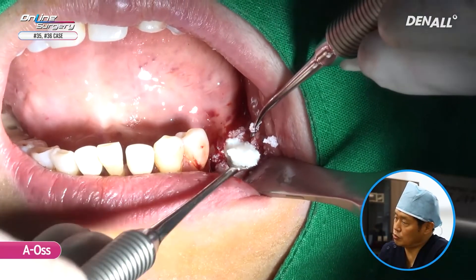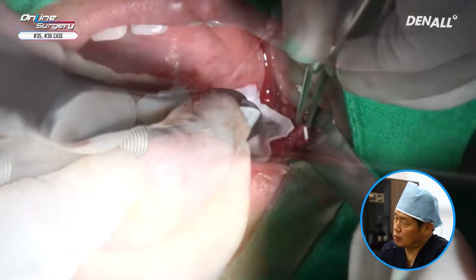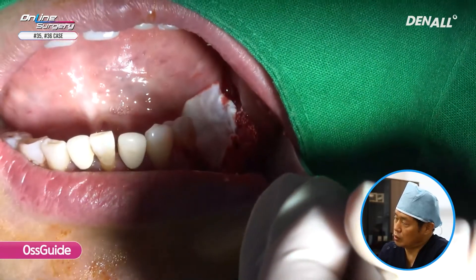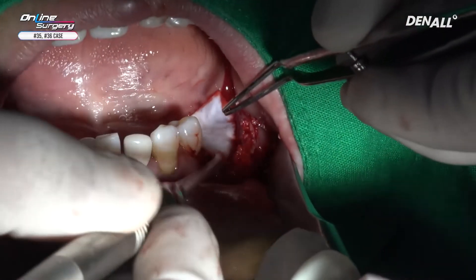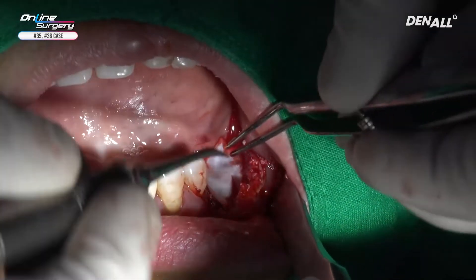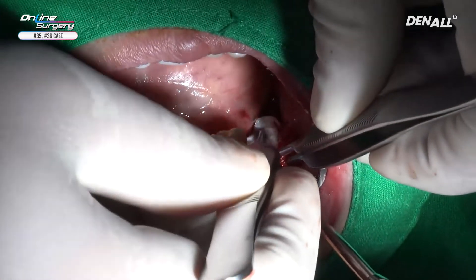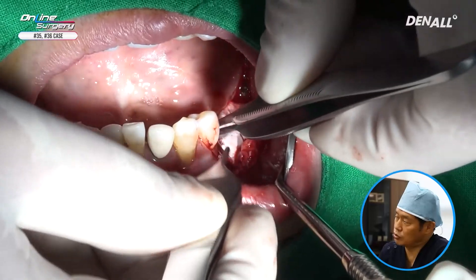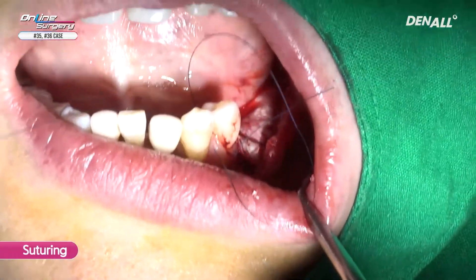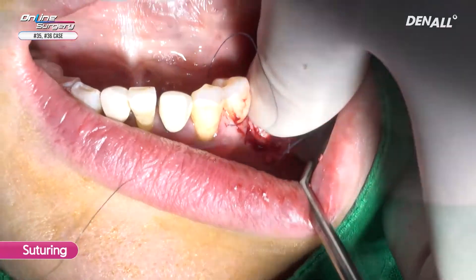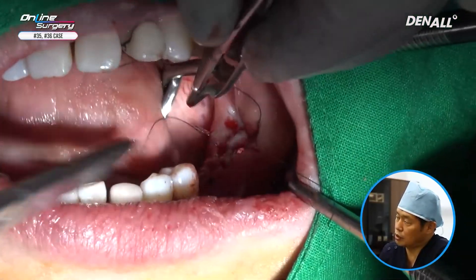On the bone defect in the back, bovine bone AOS was used for bone graft. Collagen membrane Ossix was used to cover it. One more layer was added, so a total of two layers of Ossix were used. GBR was done only on top, so even without periosteal releasing incision, the flap can be closed nicely.